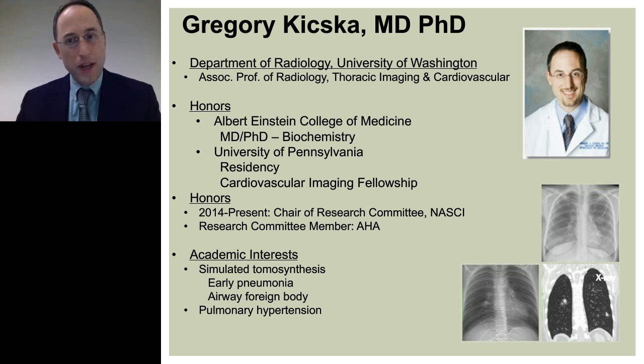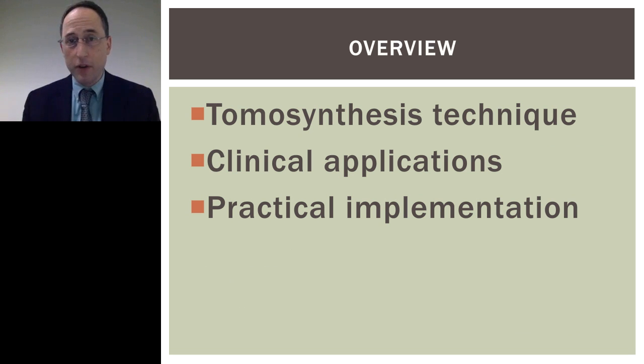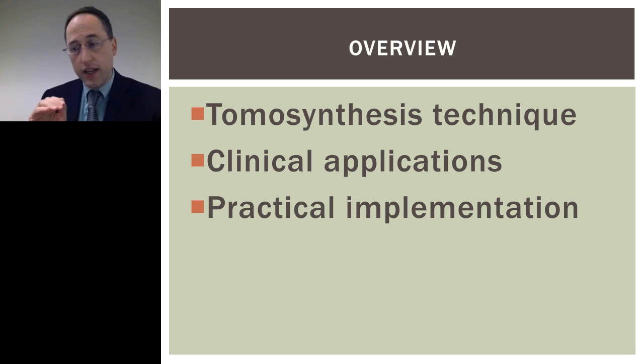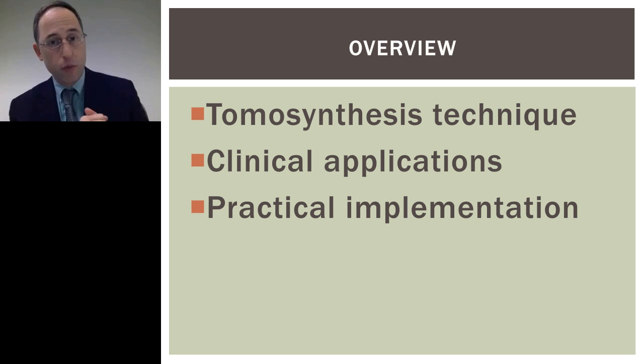Okay, so tomosynthesis. Tomosynthesis is something that many people have heard of in the past, but they may not be familiar with digital tomosynthesis. If you remember from linear tomography, this was something that used film, and of course this is a new iteration of that type of modality, and we'll talk about that in more detail.